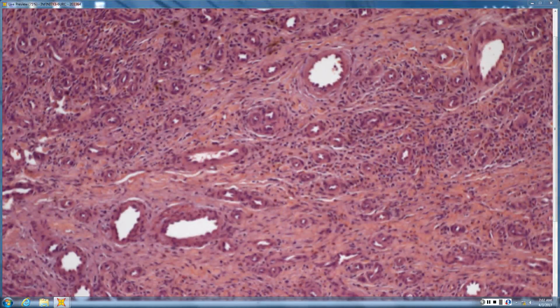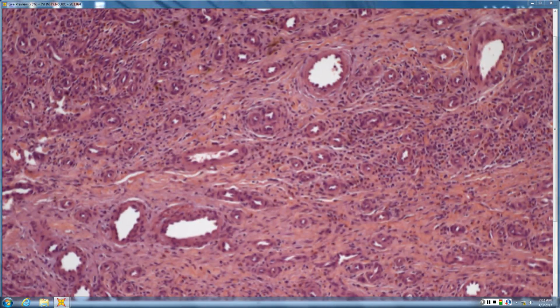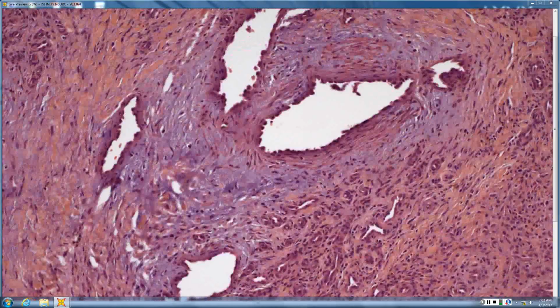And so this is a great one for the boards because it can be kind of confusing at scan, and then, hopefully as you're going through it in your mind, saying what you're seeing, you'll be like, wow, there's this vascular hyperplasia proliferation with eosinophils, and they'll pop to the ALHE diagnosis.